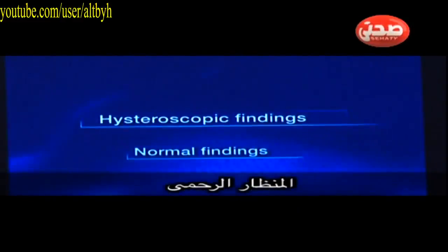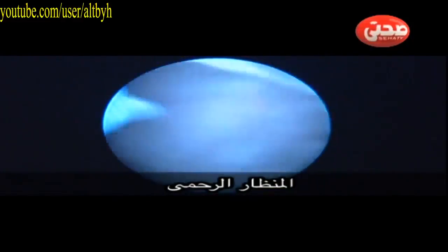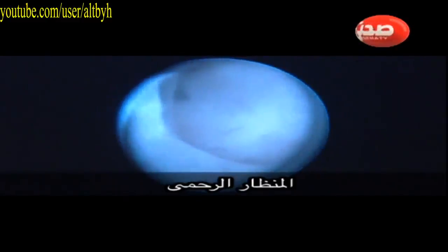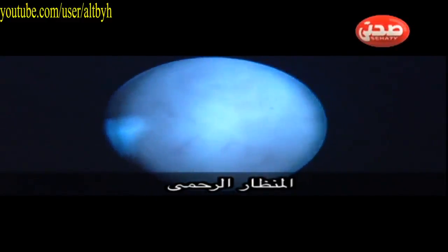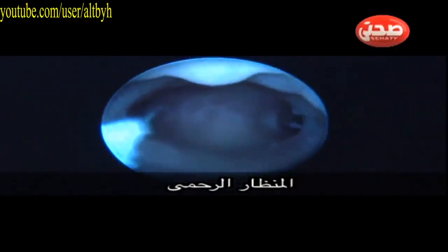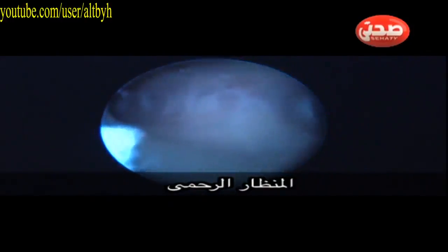And to comment on the hysteroscopy findings, some are normal findings, like in this case. This is a lady who had postmenopausal bleeding, and you can see the atrophic endometrium with no pathologies at all, and both ostia were seen clearly in the panoramic view, as you can see there. So it's very important to have a quick look and also to have a systematic review of the whole cavity.